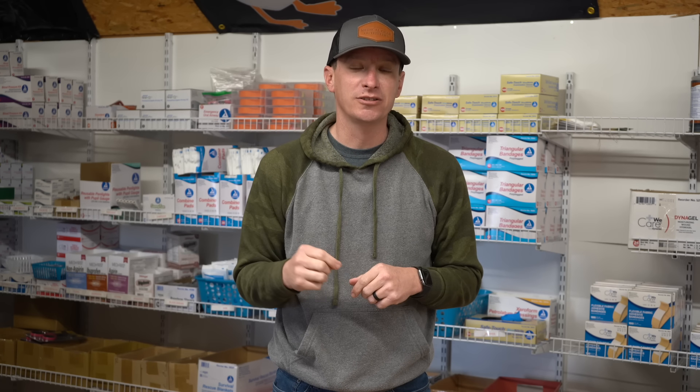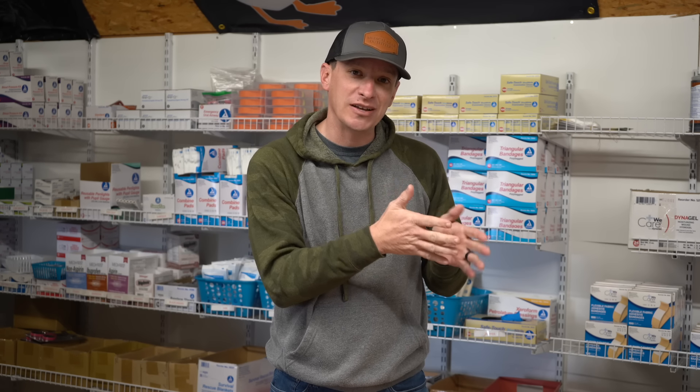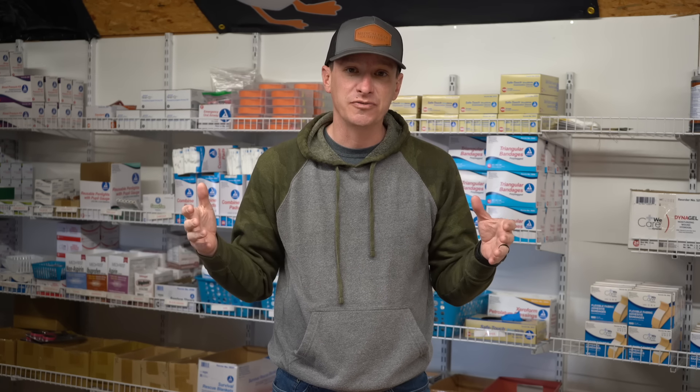Welcome to another video from Skinny Medic. In this video, we're going to talk about building the ultimate trauma kit. I'm going to take you step by step and show you where I would probably invest a little bit more money in my kit versus where you might save a little money. Hopefully this video is going to help you if you're looking at building your own trauma kit.